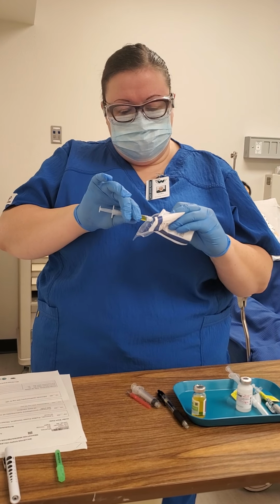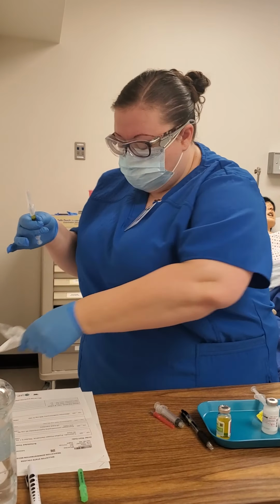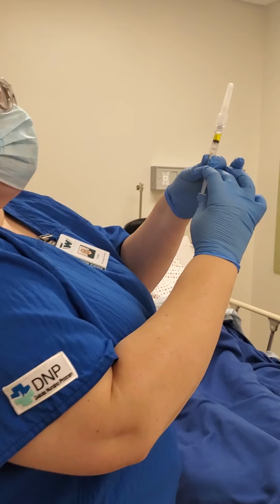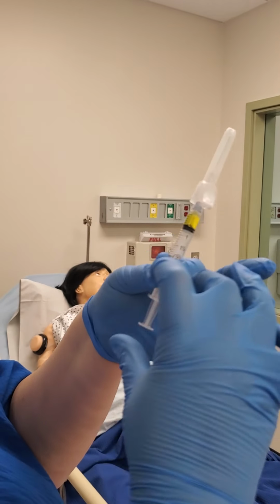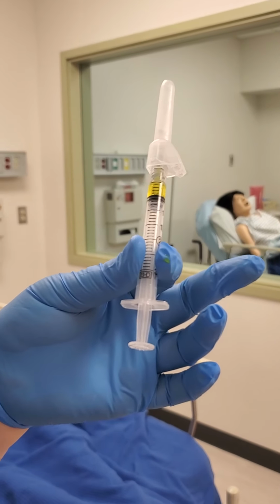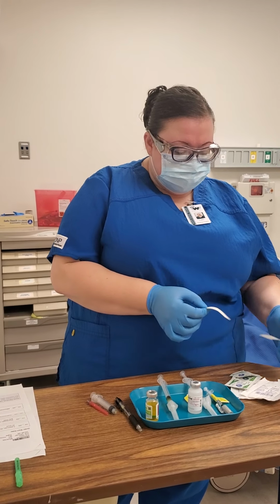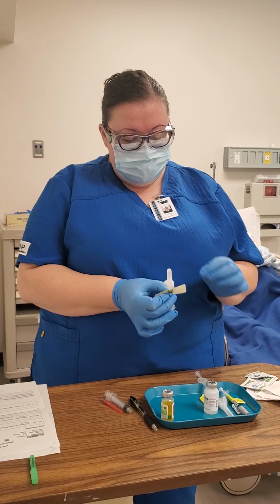My injection needle on. Okay. And then I'm just gonna take my air out of there. Okay, 0.5 then. And then I'm gonna put my label on it: Ceftriaxone 0.5 milliliters, my initials, the date and the time.